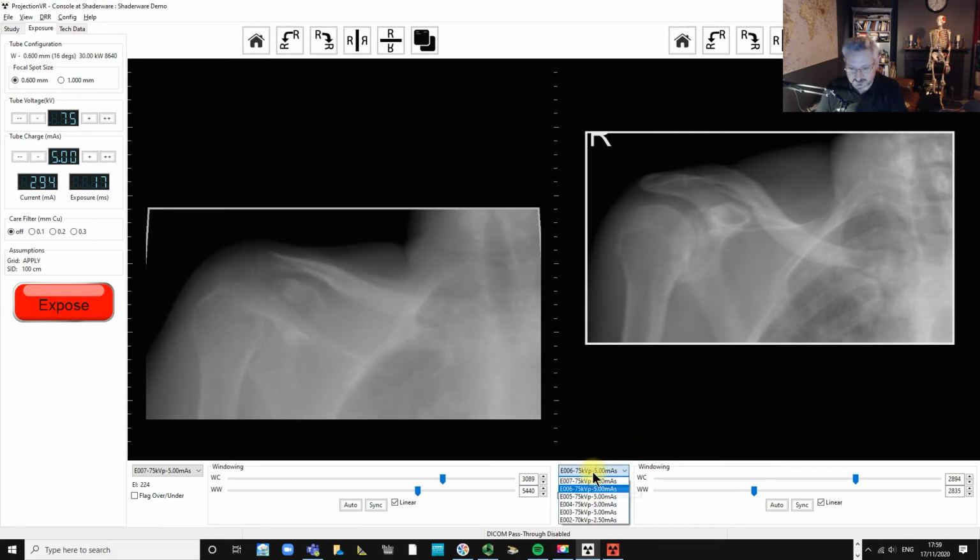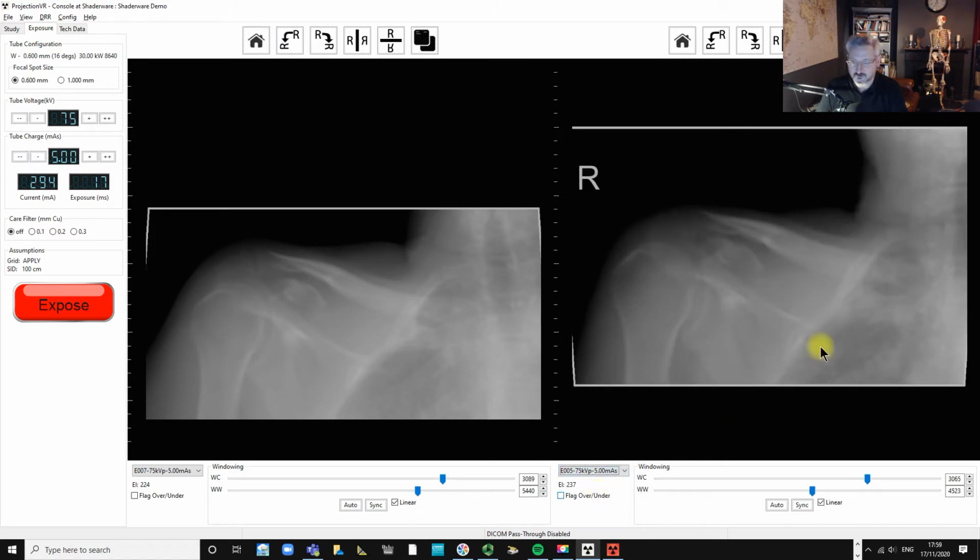And if I compare that with the 25 degree AP projection, I think this is looking better compared to the 25 degree AP clavicle. So PA has got some real benefits in terms of image quality and radiation dose.